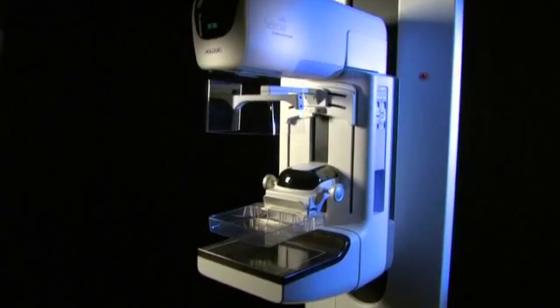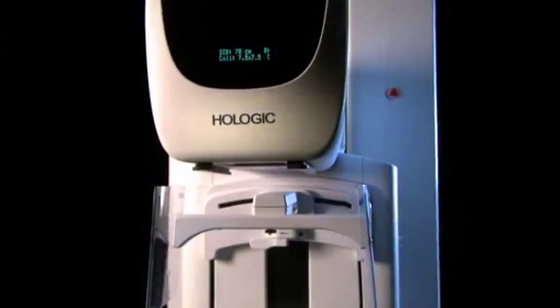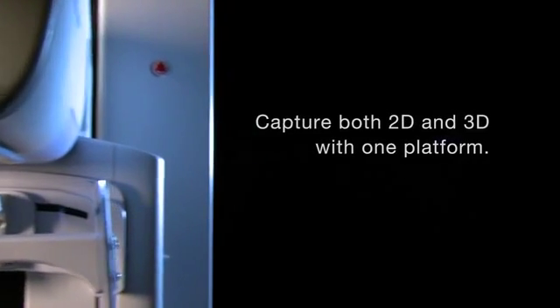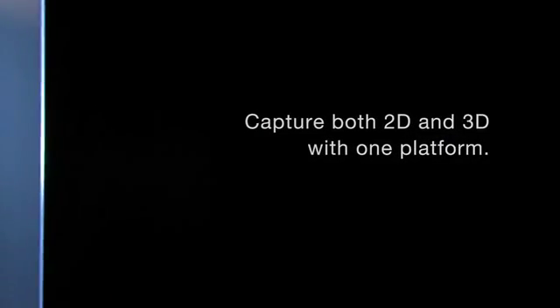Selenia Dimensions is the next generation of our Selenia Digital Mammography System. It enables you to capture both 2D mammograms and 3D tomosynthesis images using one platform.